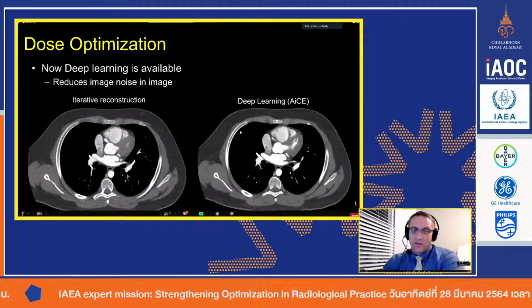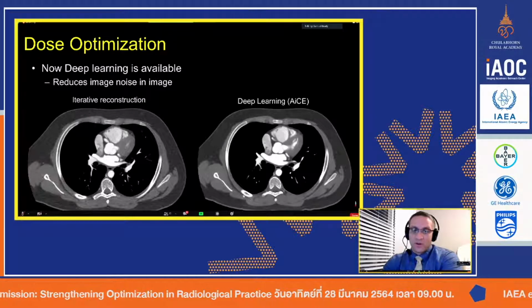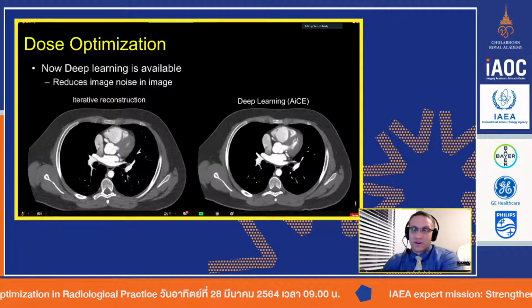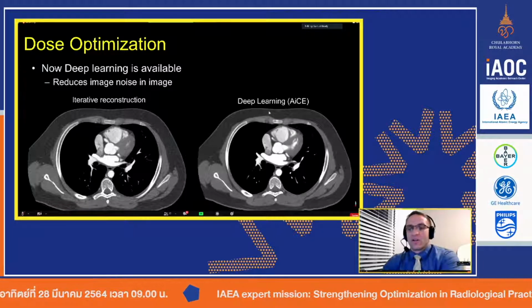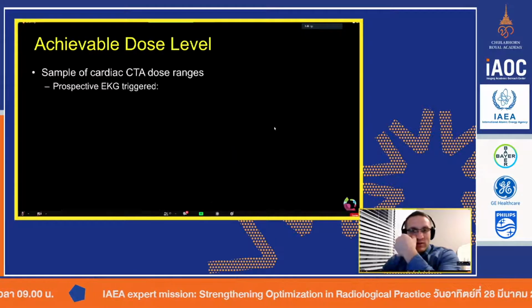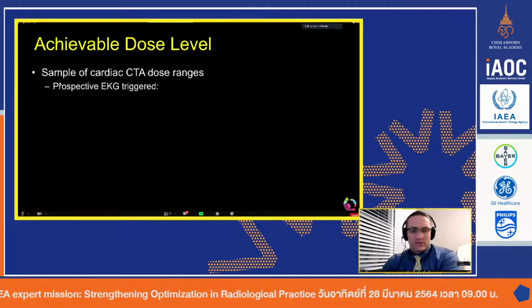So I would argue the bone structure is a little tighter, a little more edgy. And so that would be the same for the arteries and so on. If I actually had a close-up image of the heart, you would probably be able to see the coronary arteries, and the edges would be a little bit more enhanced, a little more distinct. So those are just the images.